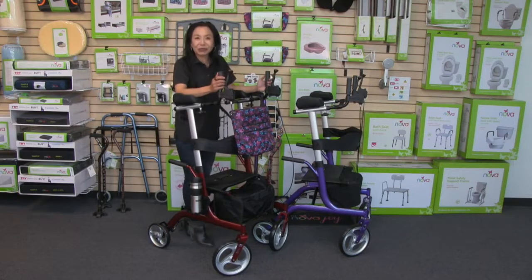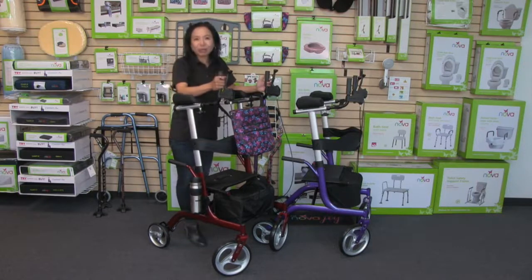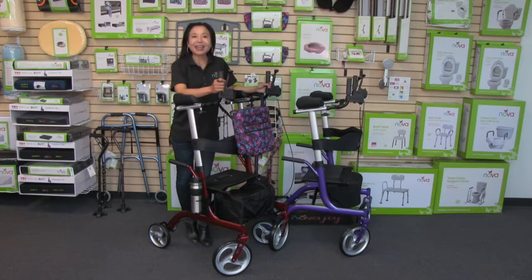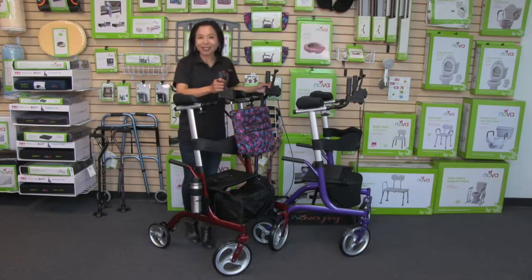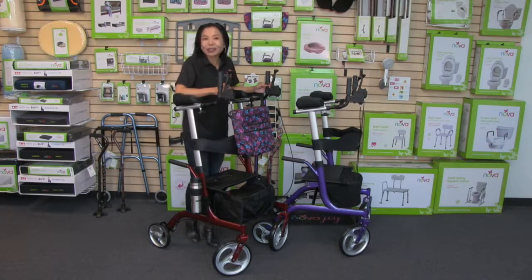The Phoenix is beautiful. It comes in three gorgeous metallic colors: purple, red, and blue. As with all NOVA products, it comes with the Nova Promise. So get out there with your Phoenix so you can rise up to life and look forward to just about anything.